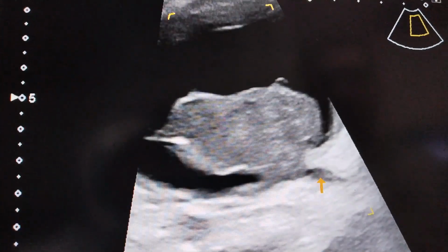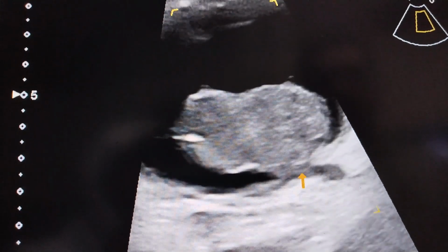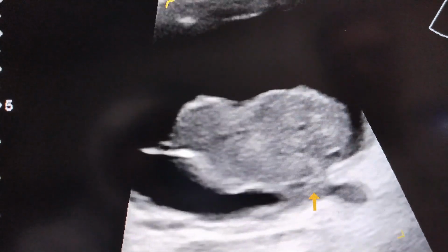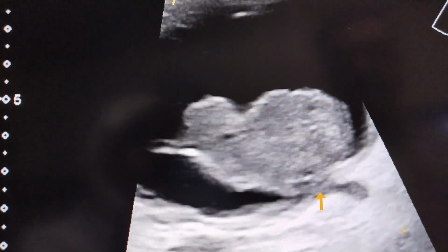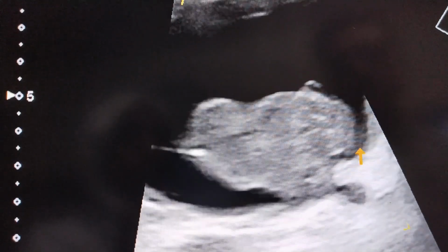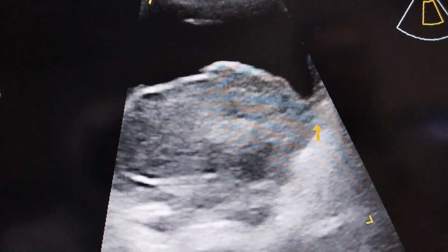Look here, this is the distal ureter, and this is the VUJ, where we can also appreciate this mass. So this mass has involved this left VUJ, and this is the lateral wall. So it is also adherent to the left lateral wall.